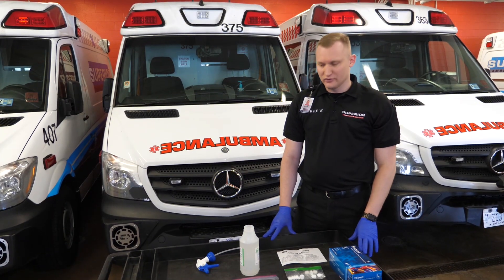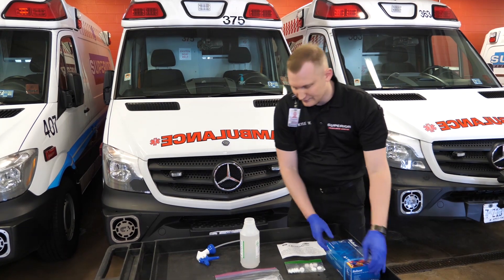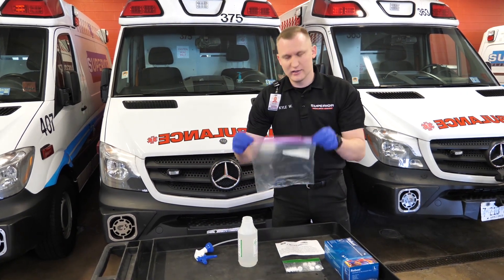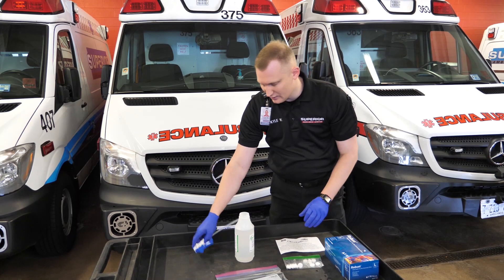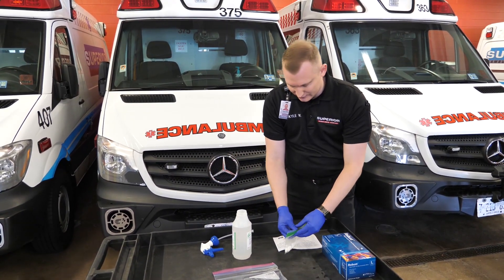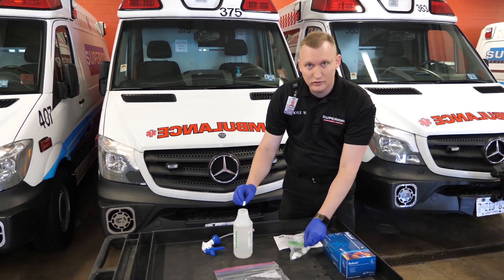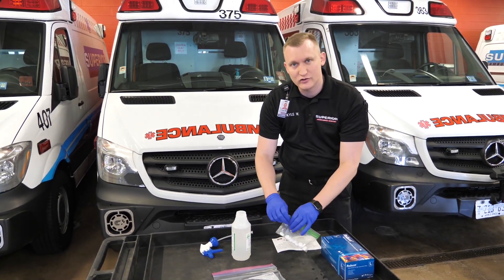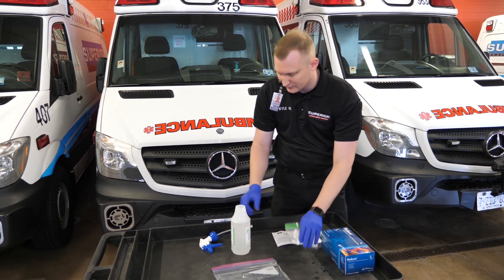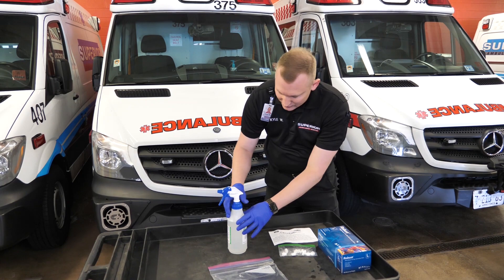Let's demonstrate our manual sprayer. To begin with, we always want to make sure we have on a fresh set of gloves. Inside of the container, you're going to have your container, your sprayer, instructions, and 10 tablets. We'll fill the container full of water and add one tablet to the solution — I'm not going to do it for demonstration purposes today and to save the product.